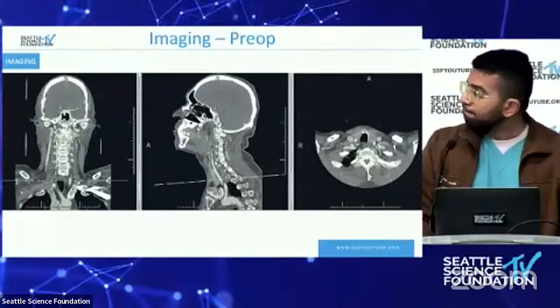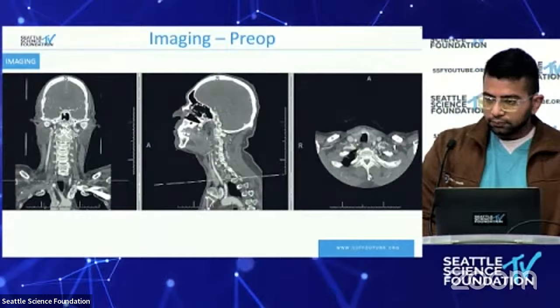One is, again, a chronic spondylotic disease with stenosis. The second one is a facet fracture with moderate displacement at C6-7, was that it? Yeah. And a vertebral artery injury. And then we have a hangman's fracture, a variant. It's a complex hangman's fracture.